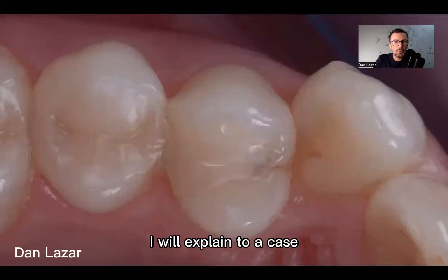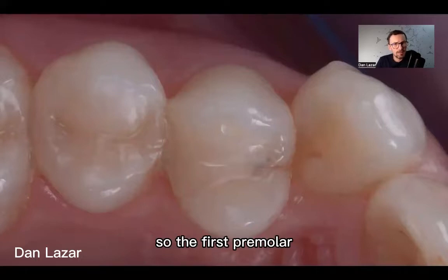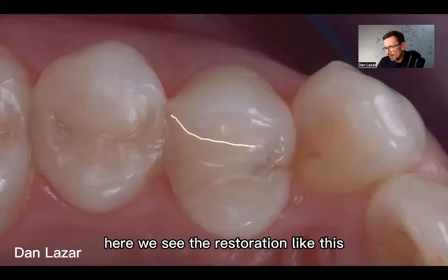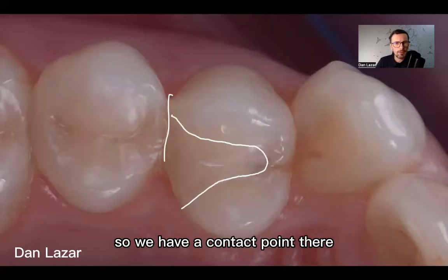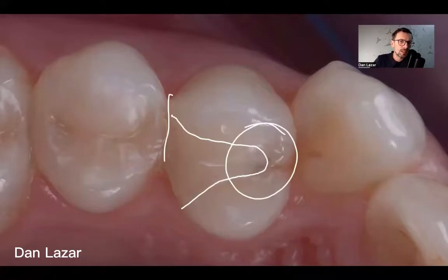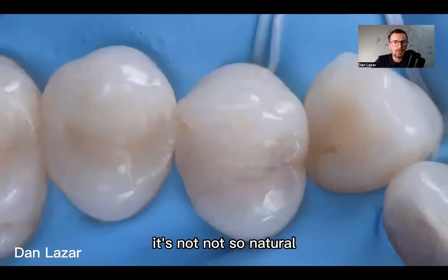I will explain with a case. This is the beginning of the case — the first premolar — I decide to change the restoration here. We see the restoration like this. So why did I decide to change the restoration? The contact point is not so bad, we have a contact point there, but this area is concerning — it could be decay. Also the morphology is not so natural.